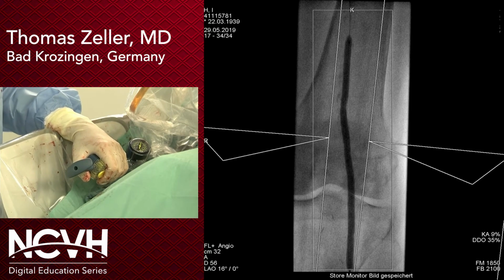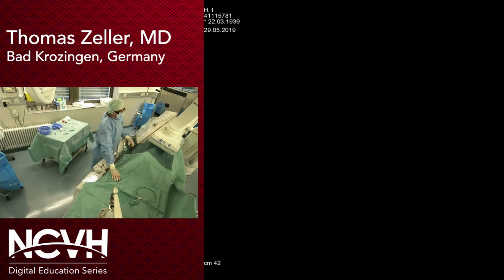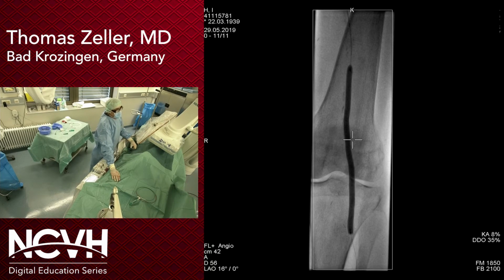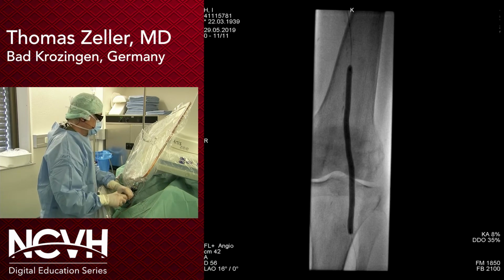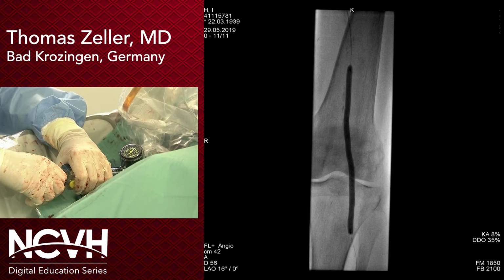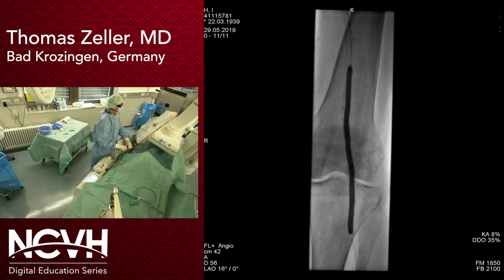So what I'm personally interested in is your current strategy regarding the use of drug-coated balloons before the FDA panel meeting at the end of June. Are you still using drug-coated balloons, or are you pausing at the moment? I think overall the usage is reduced. It's mainly a legal problem for us and not so much a scientific problem. And I think that's true all around.